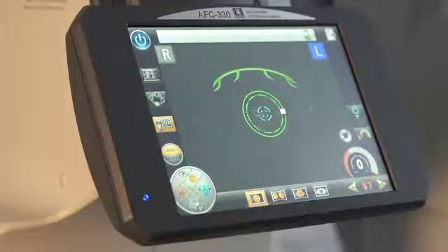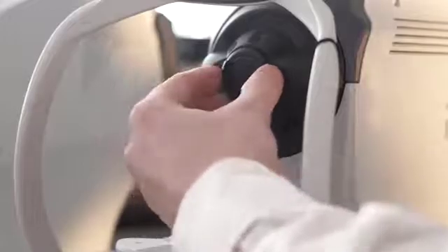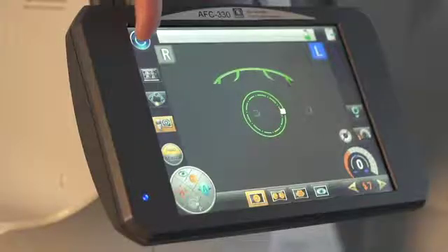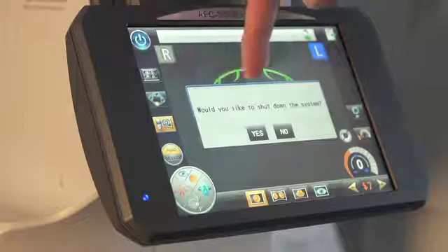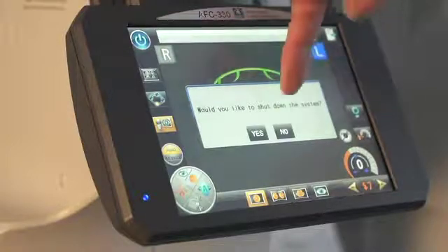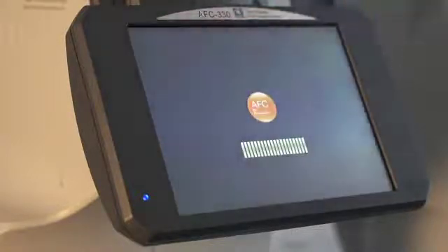When you have finished using the AFC330, remember to replace the lens cap over the objective lens. You then press the power button, and it will ask you if you wish to shut down. If you press yes, you then need to wait a few seconds for it to boot down. And at that point it will say it is okay to turn off the power.